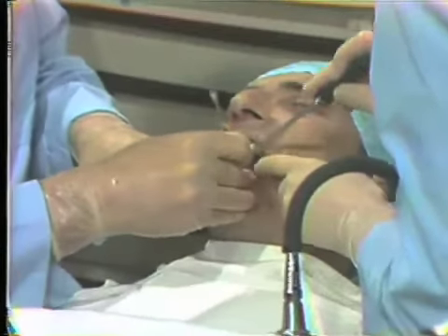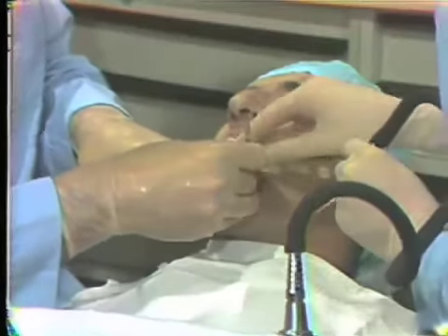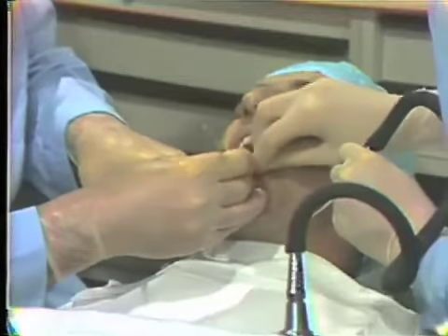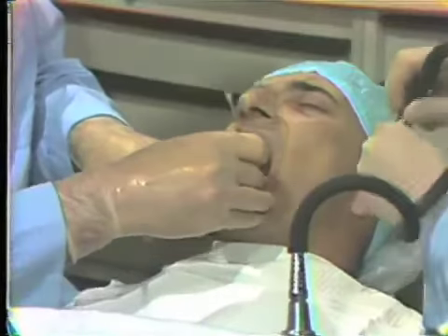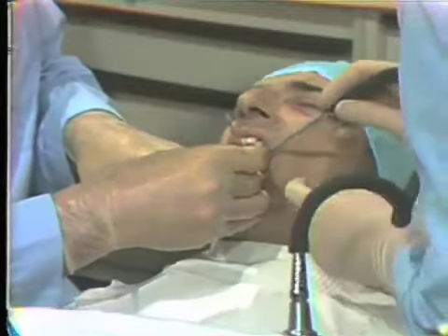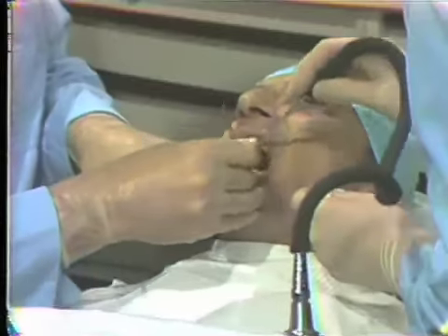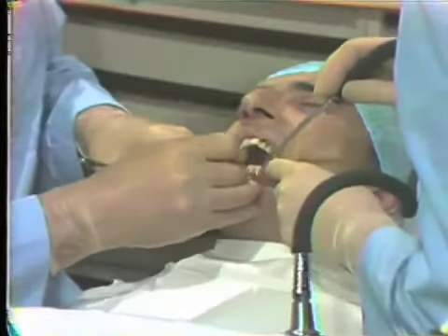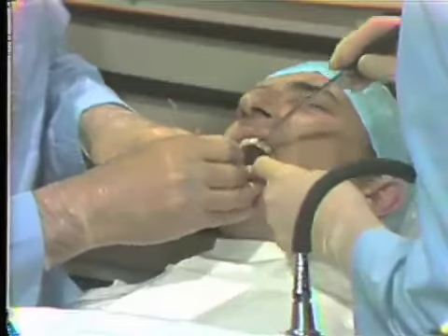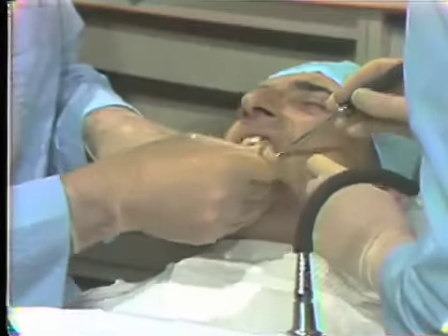There are times, in spite of using as much care as you can in the surgical procedure, that the area around the mouth of the patient becomes somewhat smeared from the oozing and bleeding. The assistant at those times can move in with a saline sponge that she has close by on the tray, wiping the areas more cleanly so that we can see, and also cleaning the area around the patient's mouth so that we do not get an accumulation of dried blood and other products in those areas.